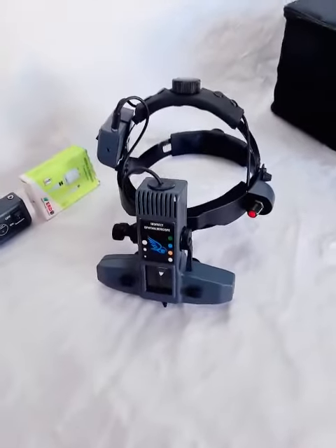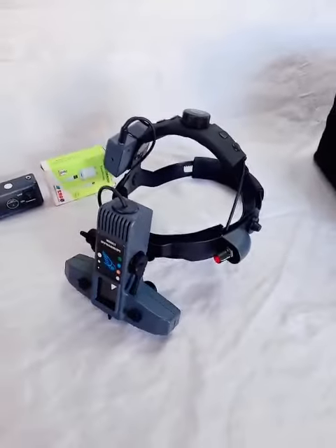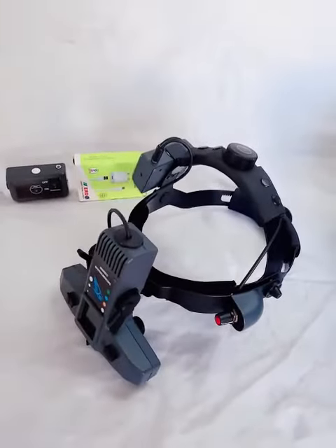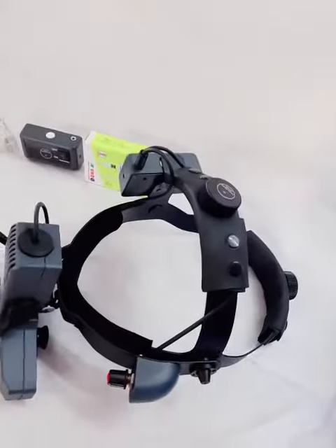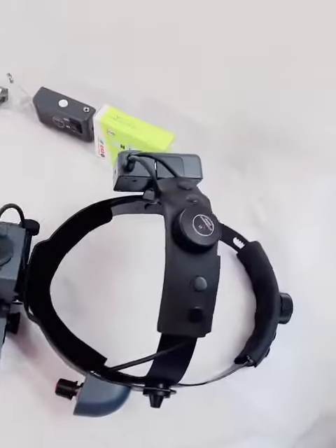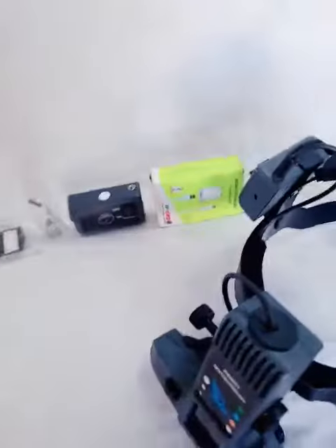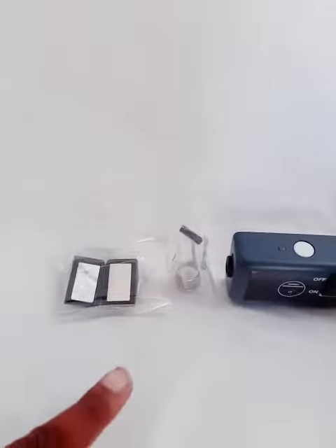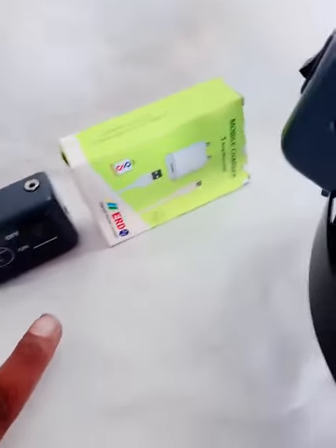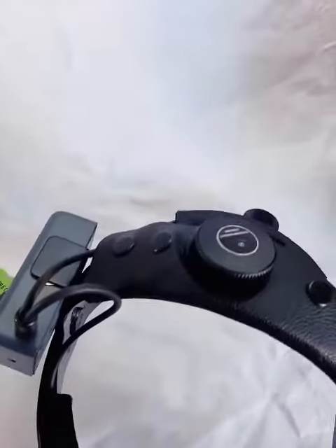Hello guys. This is the indirect ophthalmoscope, imported type. You can see the depressor and extra battery, and PRD charger. It's a removable battery.